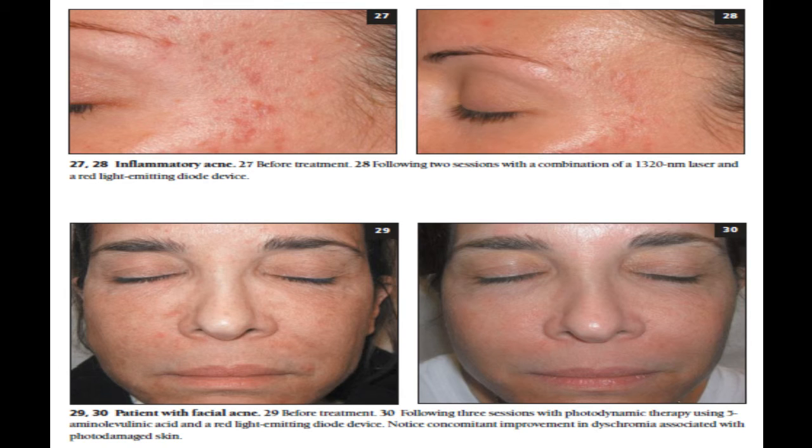The only currently available formulation of ALA in the US is a 20% solution in a single-use applicator. The solution has to be mixed immediately prior to the application by first applying manual pressure onto the outer glass tubing of the applicator to break the inner ampoules containing the active ingredients, followed by gentle rotation between fingers for 3 minutes to assure adequate mixing. The roll-on applicator tip is then used to apply the chemical evenly over the treatment area.